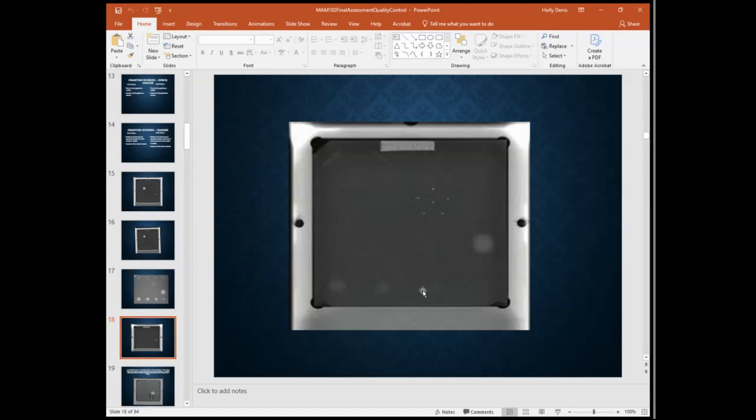Because when your facility gets inspected, they're going to look through that with a fine-tooth comb and make sure that you've done all your QC and that nothing's not been passing. Because if this hasn't passed and you still went and imaged patients, then you're not giving them the best quality images that they should be getting. Right.